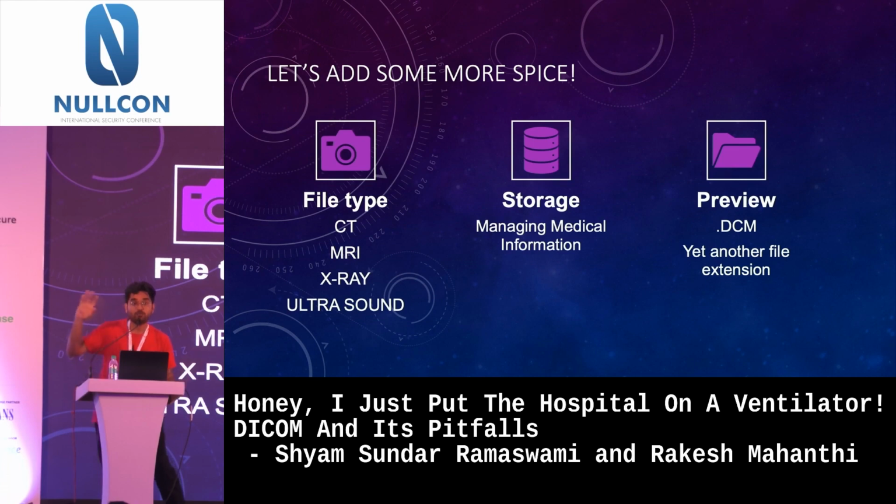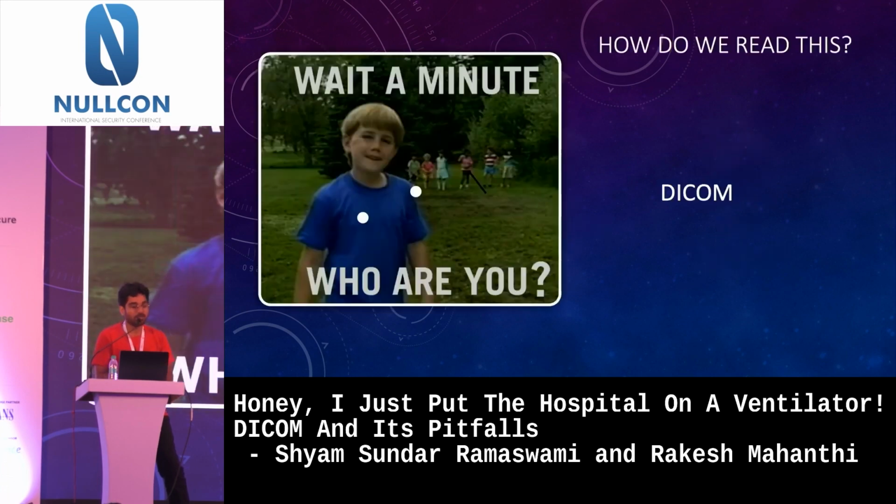And if I have to move it around, I have to view it somewhere, right? Now, that is what we call DICOM, okay? DICOM is the standard format that allows you to view these types of medical images and embed all this metadata that we are talking about and push it digitally.